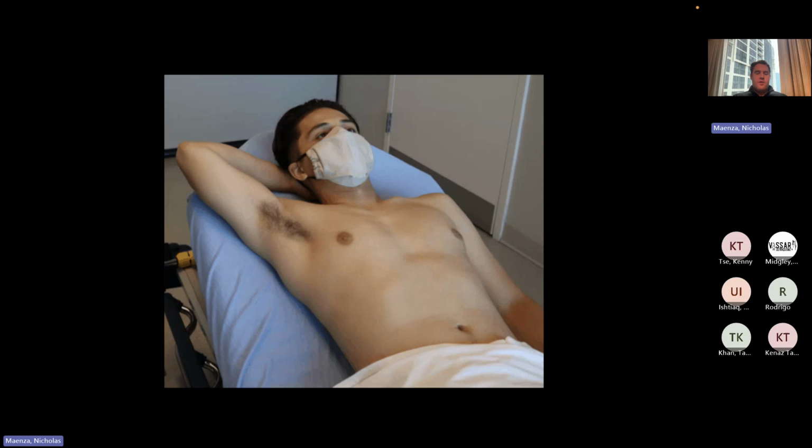And you're going to be going to a couple different spots. If you want to optimize and get a little bit better picture of the lung, you can have the patient raise their arm. So whatever side you're standing on and whatever side you're scanning, try to have them raise their hand above their head to spread those intercostal spaces and get a little bit better look through the ribs at the lung.